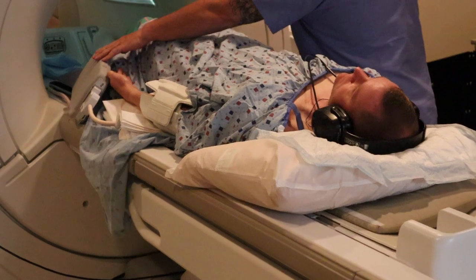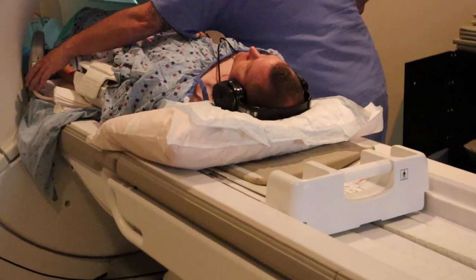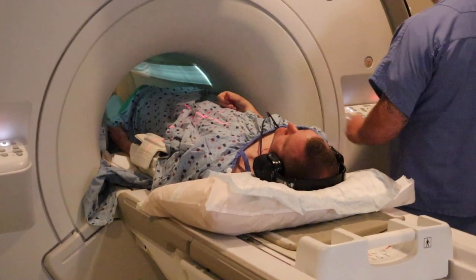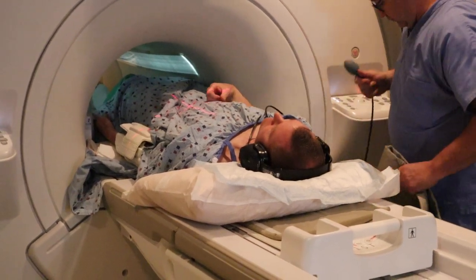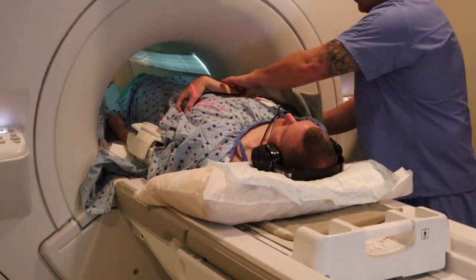Here's a little tip: you always want to ensure that you're holding the patient until they get in, that way you know that they're in nice and comfortably. Make sure to pad the patient so they're not touching the bore, especially when you're offsetting the patient.